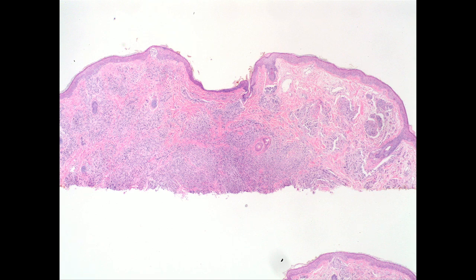Okay, and this patient had a lesion on the ear, the patient was in their 50s, and at low power, this looks like it has an alveolar pattern. But I want to point out one thing, and it's the one thing that fortunately, when we looked at this slide, made us realize that it was unusual. There's a little nest there.